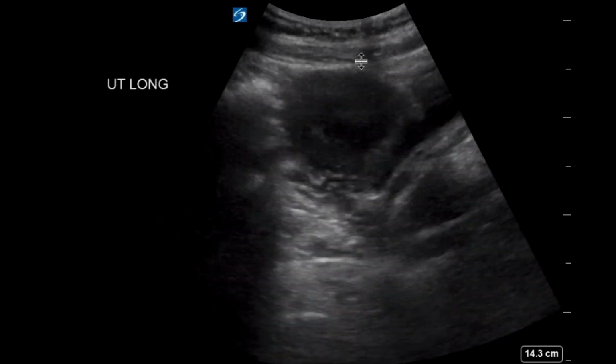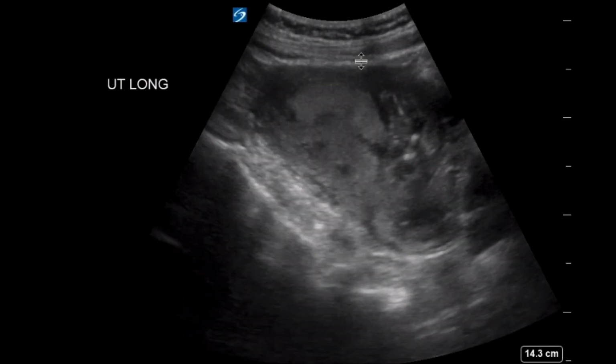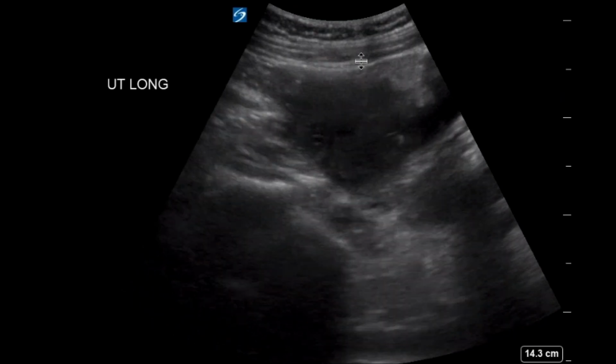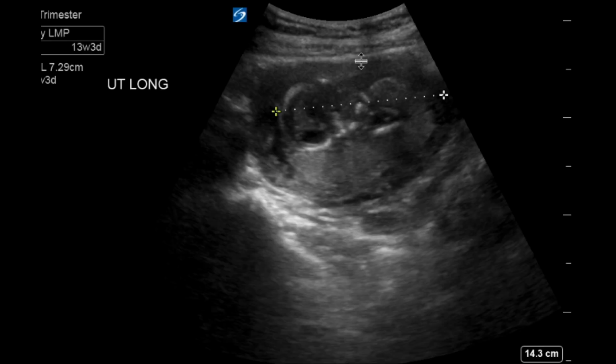Yeah, exactly. So let's take another look at the longitudinal view. We're seeing the same, where the baby's in there, but it really has no fluid surrounding it. So this is unfortunately a grave condition for the baby, and it's not survivable in an early gestational age, just because the baby's now exposed to external elements. Technically it can increase the risk for the mother to get infection, sepsis, hemorrhage, and unfortunately it's a non-survivable condition for the fetus. It's measuring at 13 weeks and 3 days here.